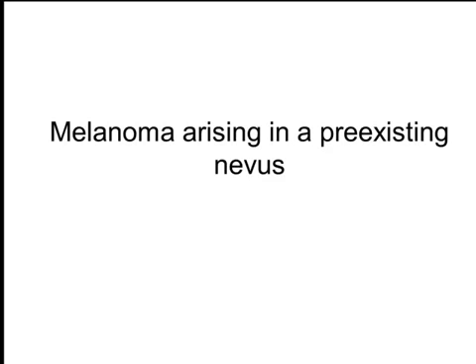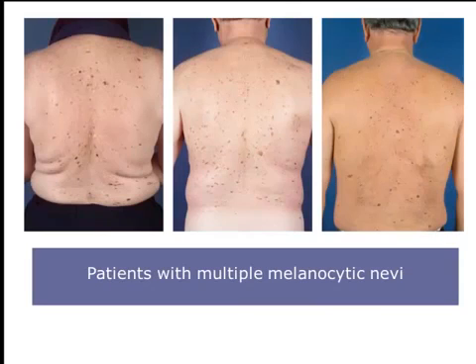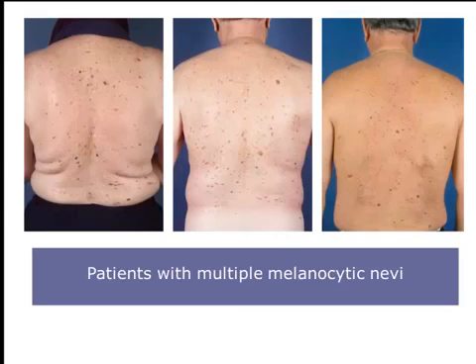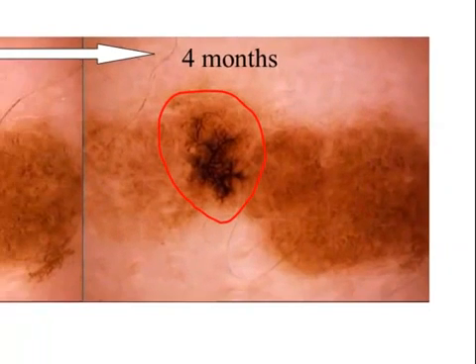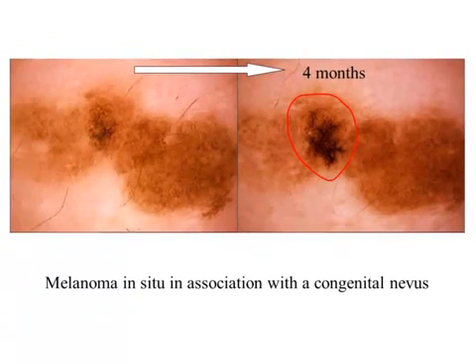What about melanoma arising in a pre-existing nevus? As I mentioned in the first broadcast of this series, patients with multiple nevi have an increased risk to develop melanoma, but usually when a melanoma develops it appears de novo and not in the pre-existing nevus. Here is an example: a melanoma in situ developing in a pre-existing nevus. The dark reticular pattern in the center of this lesion is changing, although the other part corresponding to the congenital nevus is not changing at all.